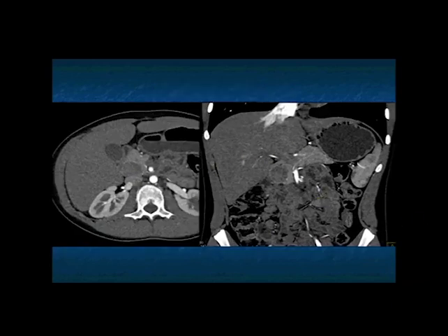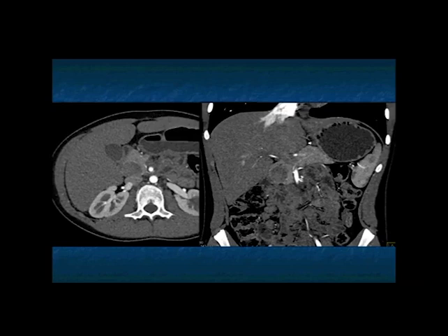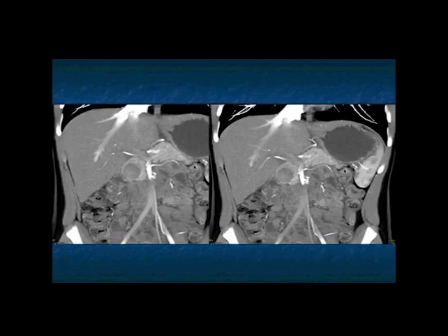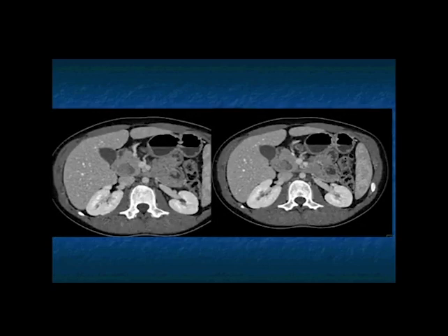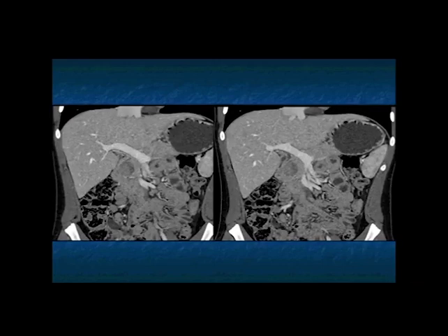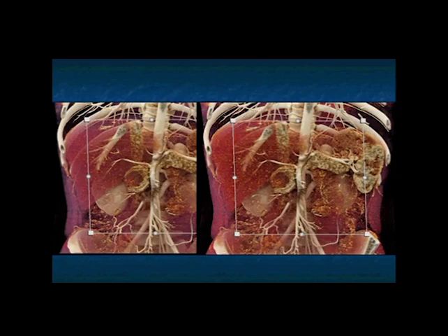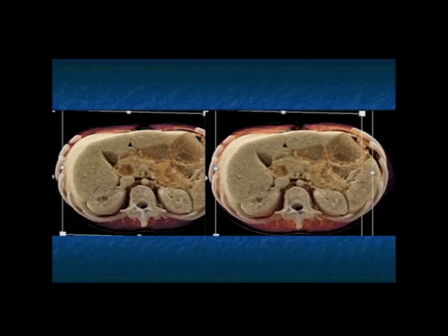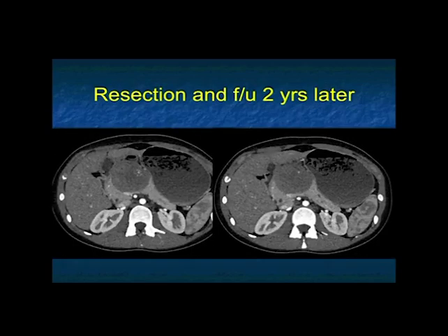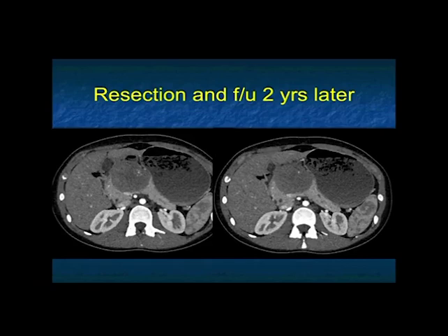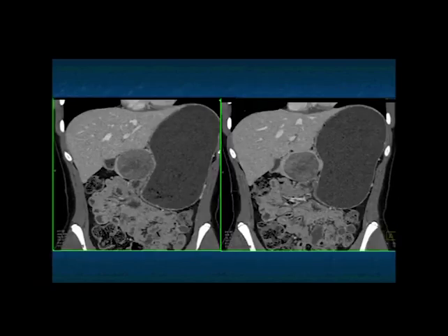Another patient with abdominal pain: a cystic, well-defined lesion. You can go through a differential from carcinoma to serous cystadenoma. This patient was a teenager, so the most likely diagnosis is a SPEN tumor. SPENs can have high density centrally and are typically well defined. This was eventually resected, but it recurred a couple of years later — look how much larger the mass is, with some calcifications. 90% of SPEN tumors resected are cured, but 10% act aggressively, and this appears to have been one of those cases.